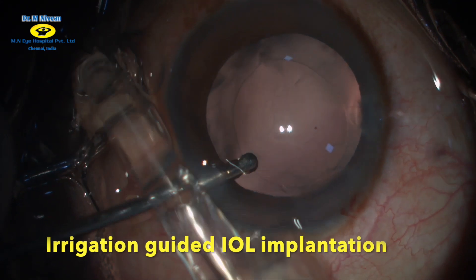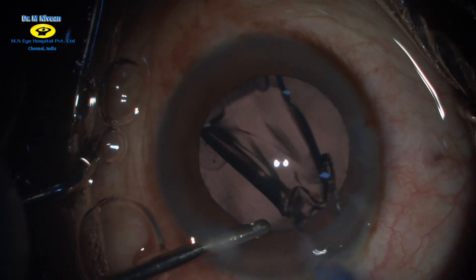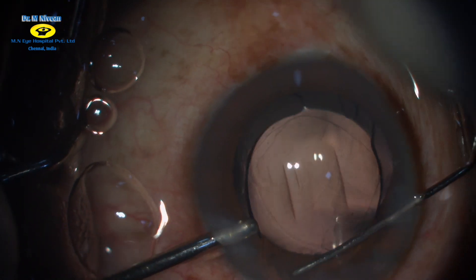Under irrigation, a single-piece foldable intraocular lens is injected into the bag. Using a dialer, the trailing haptic is placed into the bag.